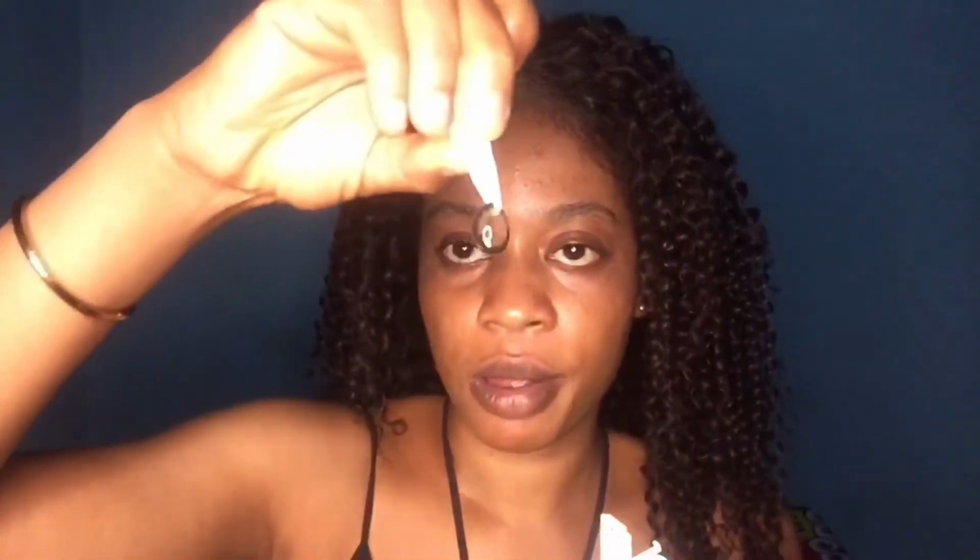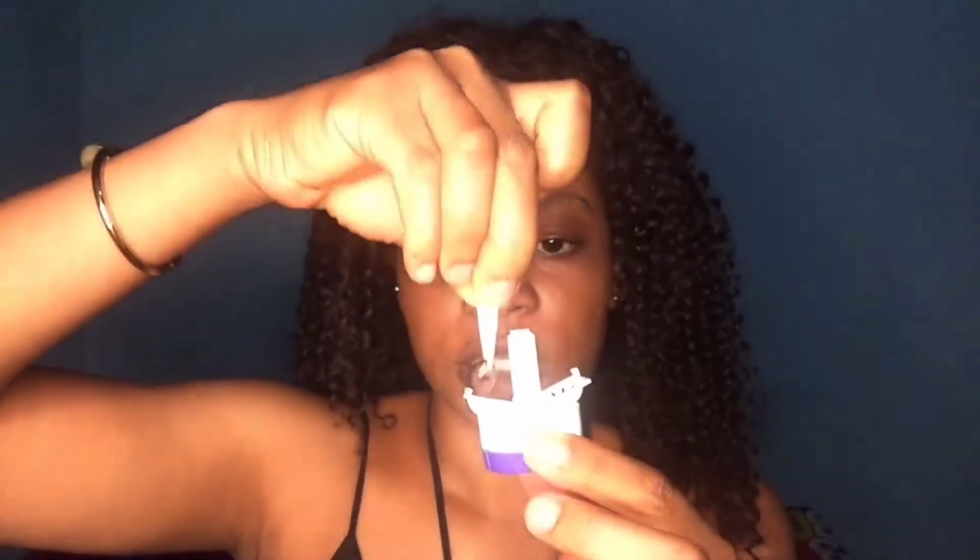Now you open it like this. You see? So I'll pick my contact lens and place it here, and I'm going to make sure it's facing upwards. Then I close this. I'm going to do the same thing here.